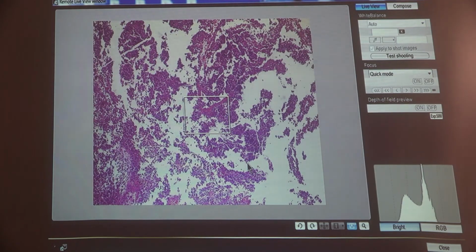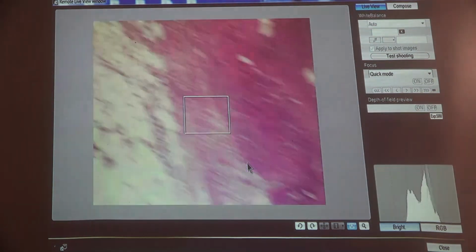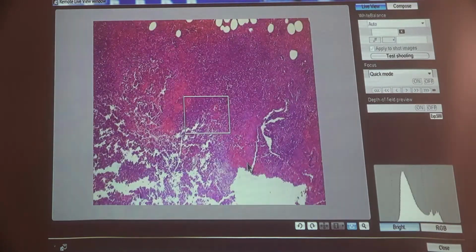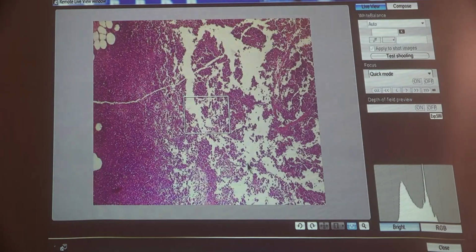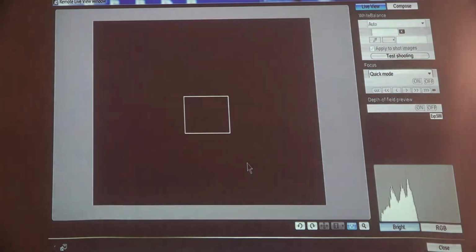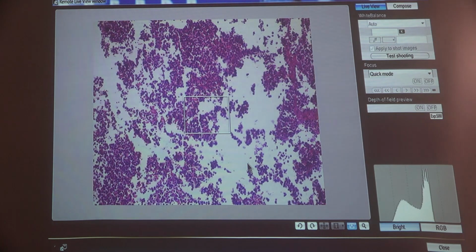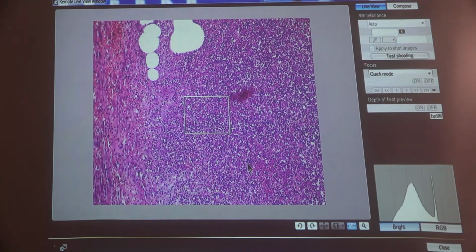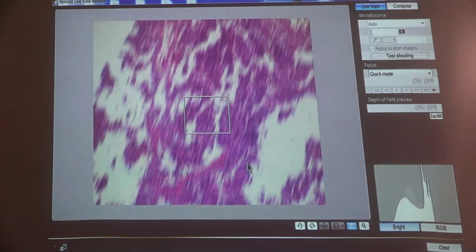This slide represents an example of acute inflammatory process in which there is acute appendicitis. This slide is an acute appendicitis. There is heavy infiltration of acute inflammatory cells, mainly neutrophils, in the mucosa, in the lumen, in the submucosa, and in the muscle layer. These are the inflammatory cells infiltration. This is the lumen, pus cells in the lumen, acute inflammatory cells in the lumen.